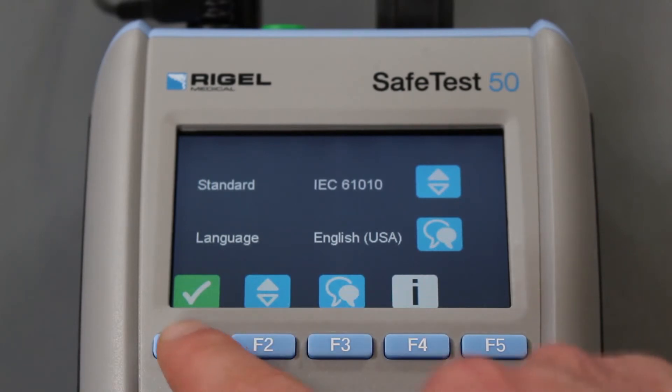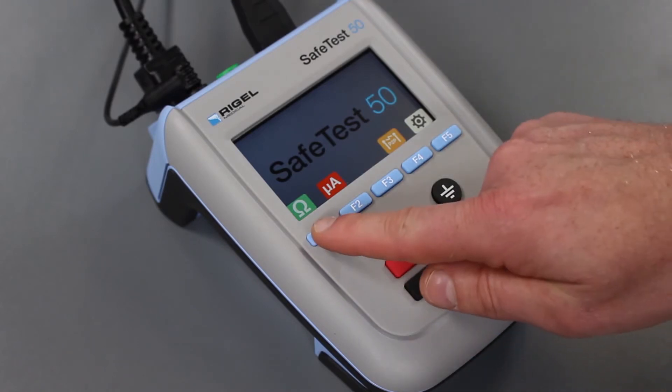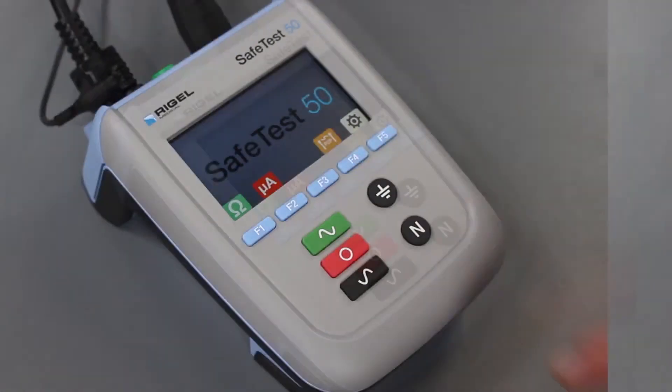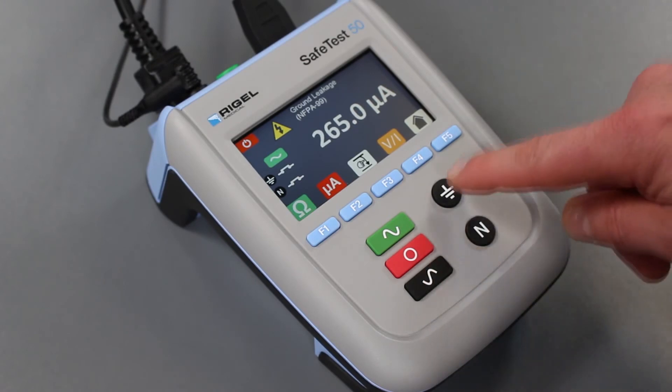Testing is fast and simple with rapid boot-up, as well as an easy-to-navigate color screen and dedicated function keys for performing reliably accurate ground bond, leakage, and point-to-point testing. To reduce test time, line voltage is applied manually, as well as the single-fault conditions, open ground, and open neutral.